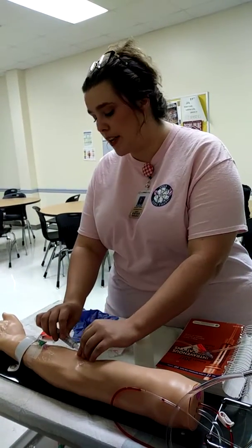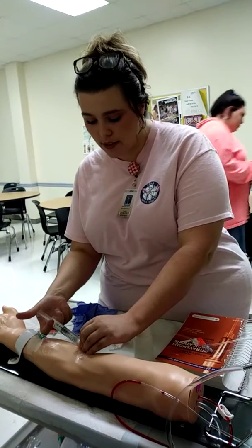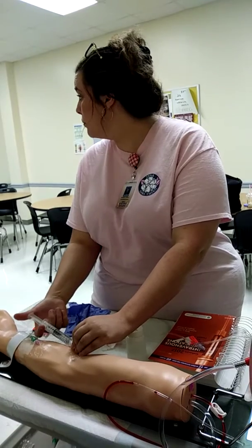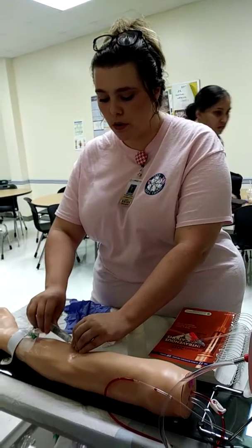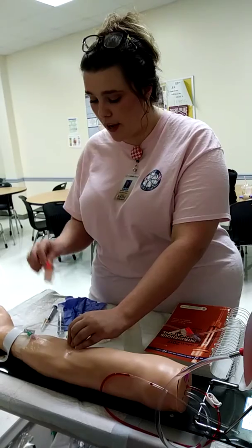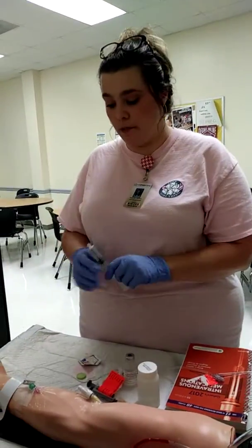And I'm going to connect it. Once I connect it, I'm going to push, and I'll push it through this entire time. The IV's flushed. We're good. Now, pause it.